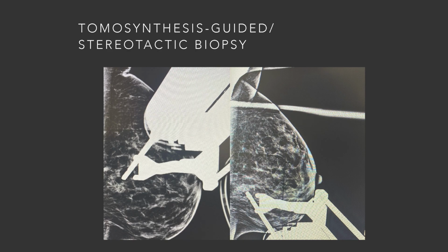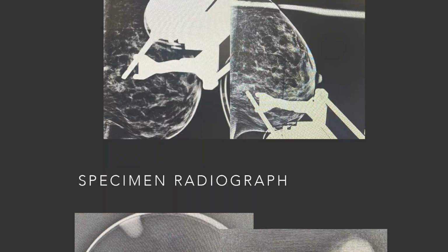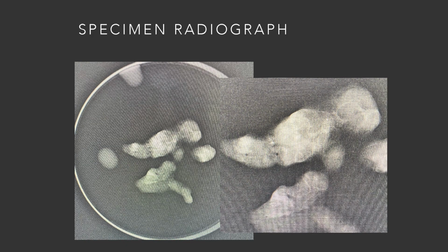These are images from an actual stereotactic biopsy. The actual target, which are clustered calcifications, doesn't project very well on these images, but at the very tip of the needle, there are very fine calcifications that were biopsied there. And again, I apologize for the quality of these images. It's not coming across very well, but this is an example of a specimen radiograph on the left and then just zoomed in on the right. But there are just some tiny calcifications, which are the little white spots in the center of the specimen.